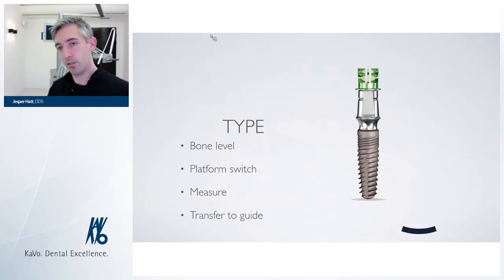So our considerations in regards to our aesthetic plan here is using a bone level implant, could be any kind. We want a platform switch because we know that's a requirement if we want stable soft tissue afterwards and a stable emergence profile.